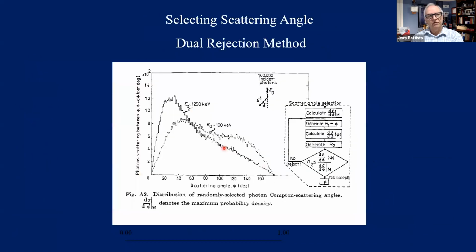So that's pretty straightforward. Now looking at the photons and how we decide if it is a Compton event, where the photons go. This is a scattering angle distribution. Let's just look at the cobalt one here. By the way, this may look a little bit different from what you see in the textbook because it's the probability per unit planar angle, not per unit solid angle. But you call one random number here.